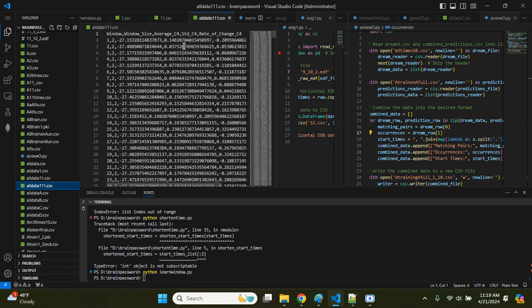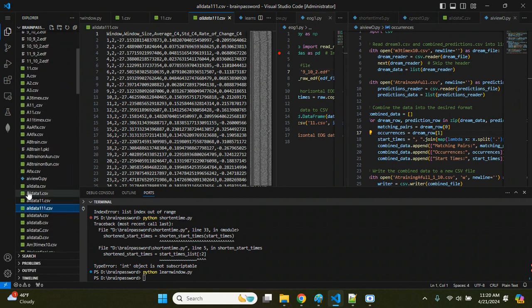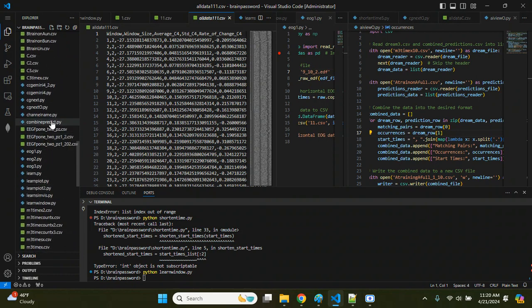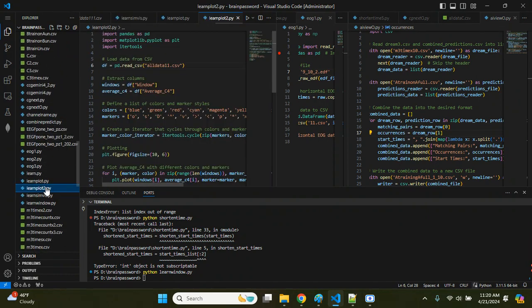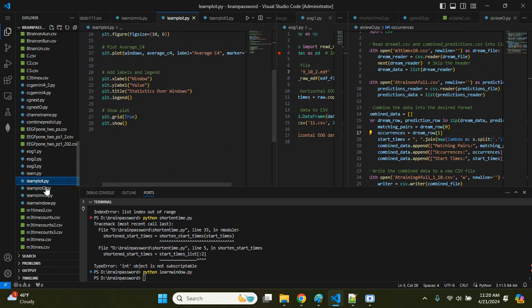And the interesting part was how we managed to develop a system where it was able to visualize, from my background in Python, Matplotlib. I knew how to put shapes in different times. And what file was that? Learn plot, I think. Yep, learn plot, where we visualize it.